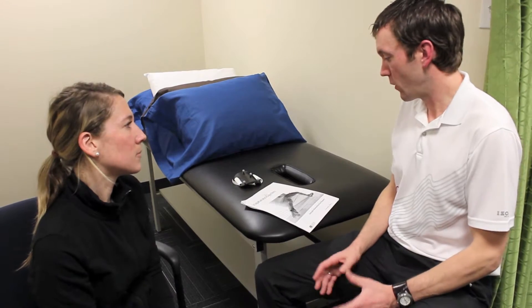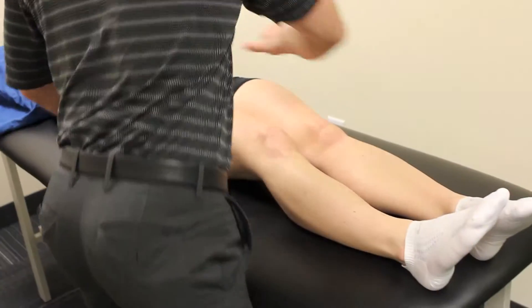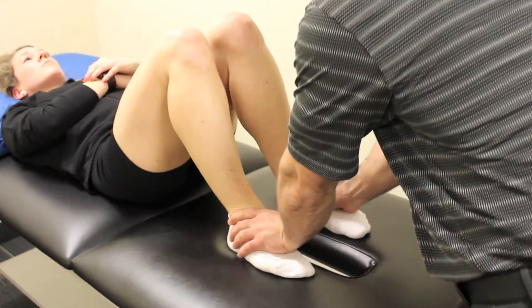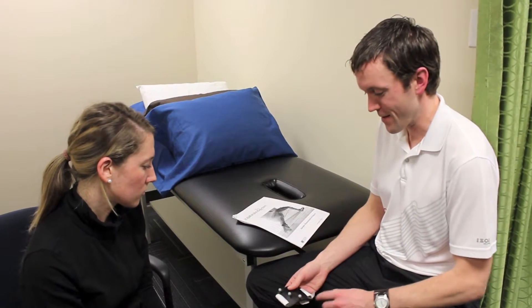Claire, what we're going to do today is get a look at your running stride. We want to do a little bit of a physical examination first, just like you would normally get at a physiotherapy clinic, and then we're going to use some reflective markers that look something like this.